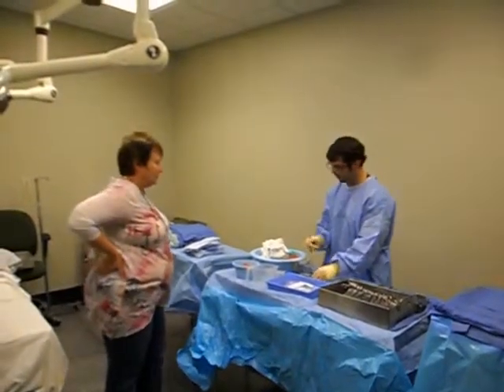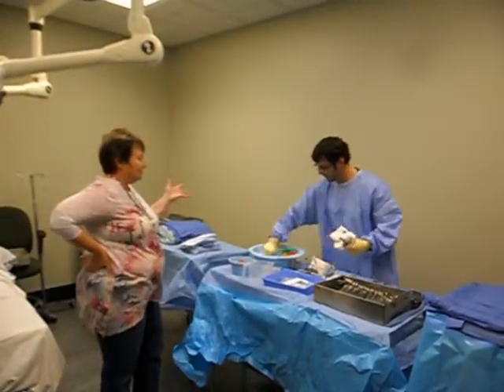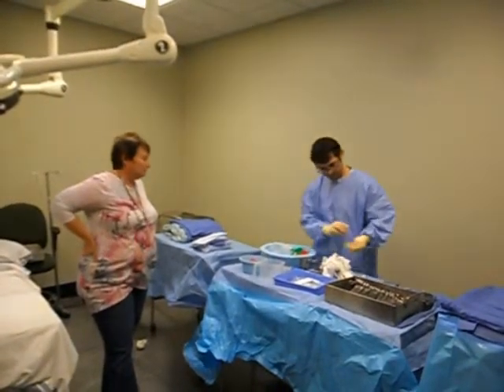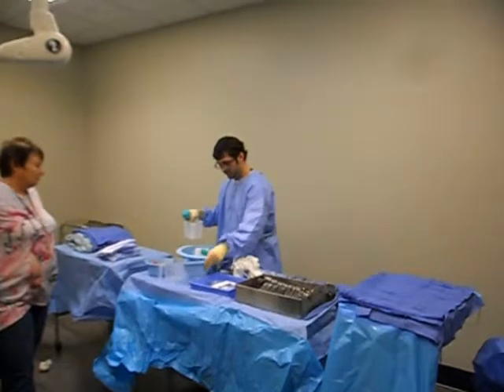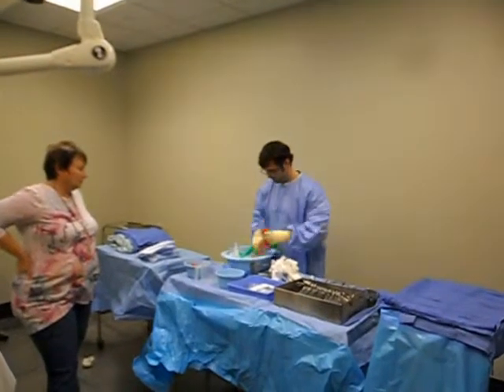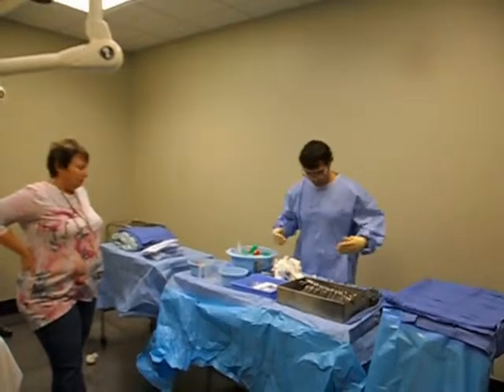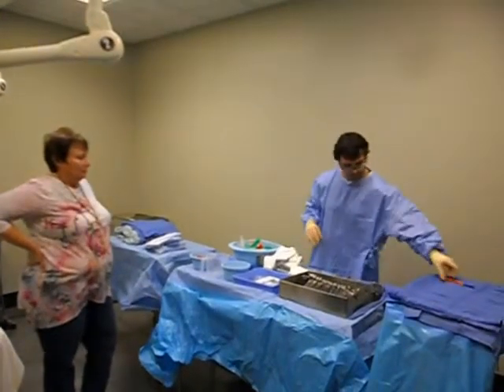Kittners. So you've got laps to count, you've got longs. You probably wanna pull all of that out first, because your blades would be in there. Kittners for this procedure. I'm cramped for space here. Are you gonna have meds? Probably not, so why not stick that up in your mayo stand right now? Your skin scribe or your marking pen.